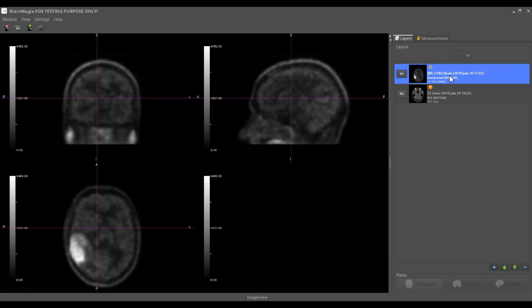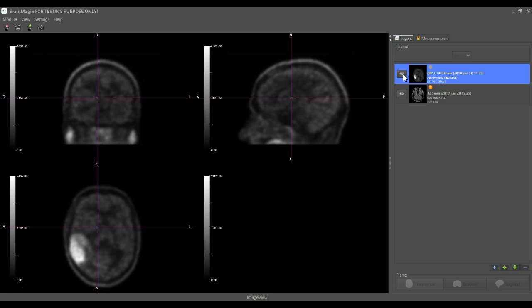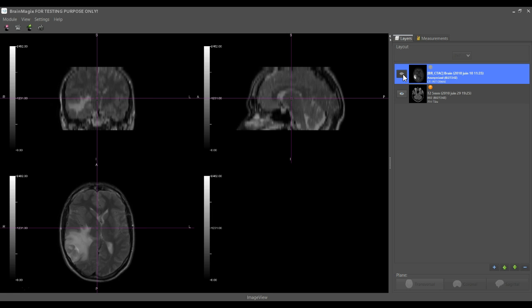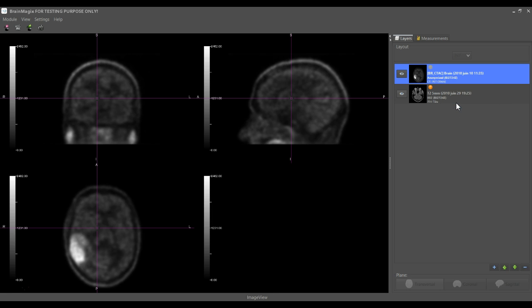You see that the PET scan is added here to the Layer Manager — you can switch it on and off — but you see that it's not registered. So let's right-click, select Register, and it will register the PET scan on the MRI.